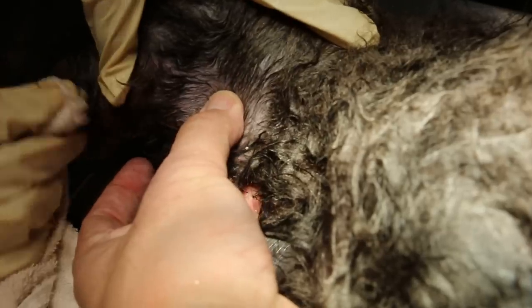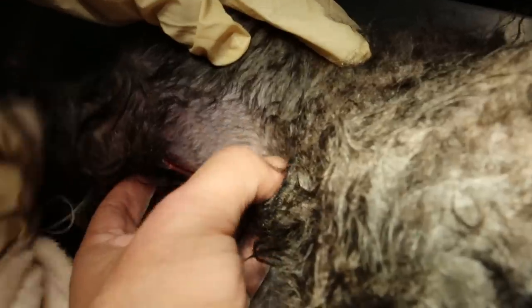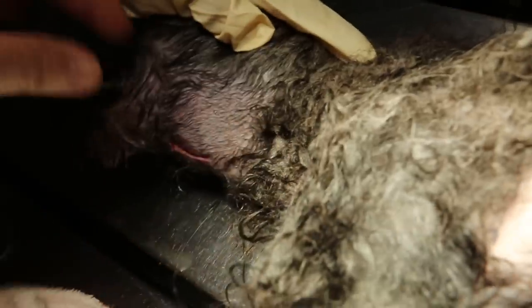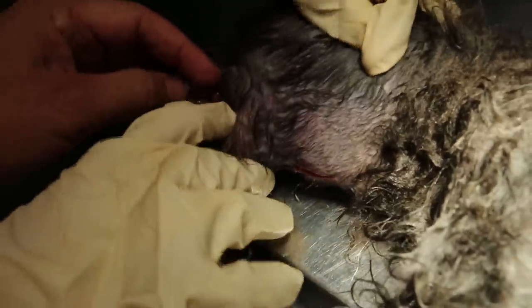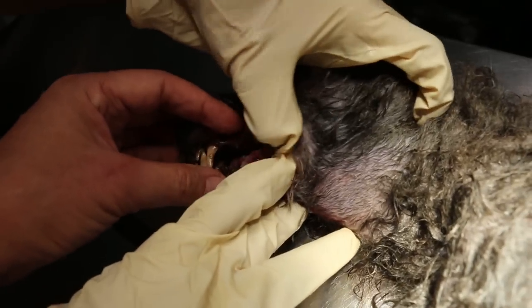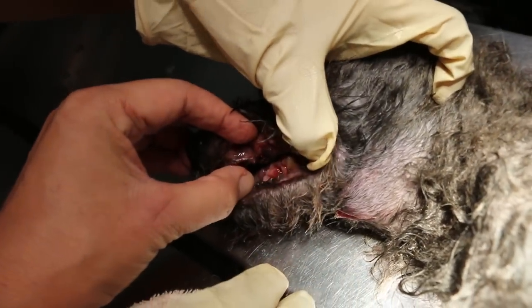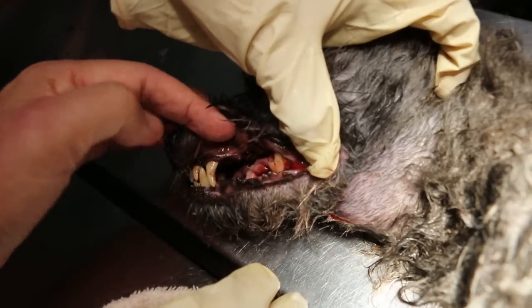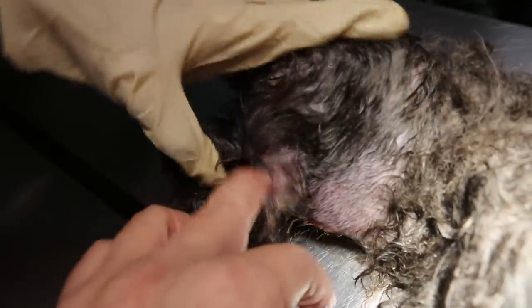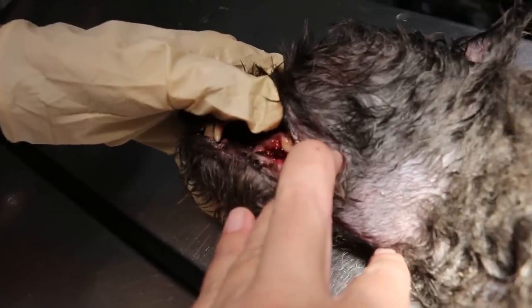And so they said the dog couldn't breathe properly because the whole throat is swollen, surrounded by pus. And the tongue was cyanotic yesterday. And the blood test shows white cell count was 3-4 times normal. And now you can see the dog is not really panting. I extracted the upper teeth, and the other tooth I extracted, but this lower one is okay.